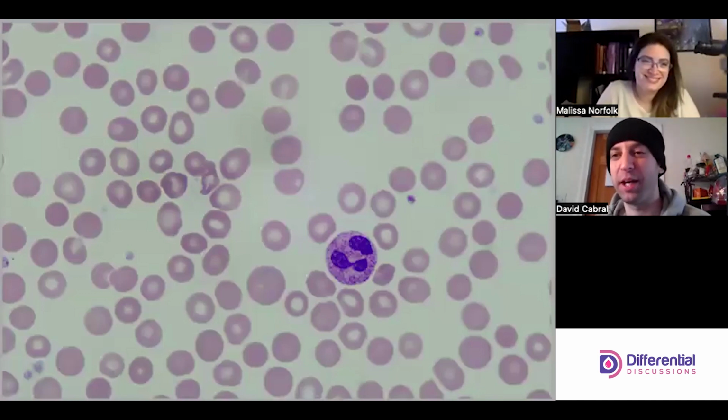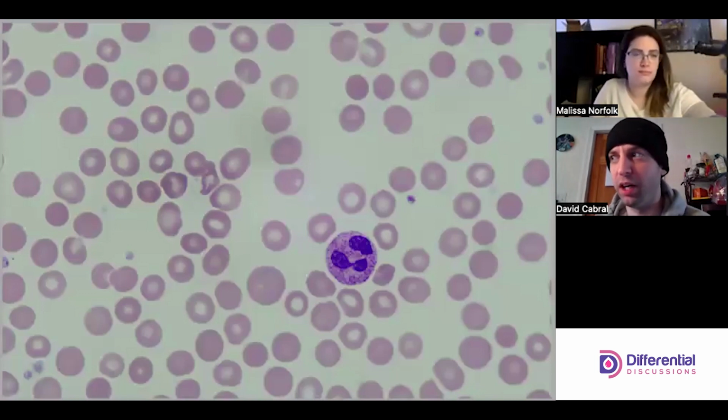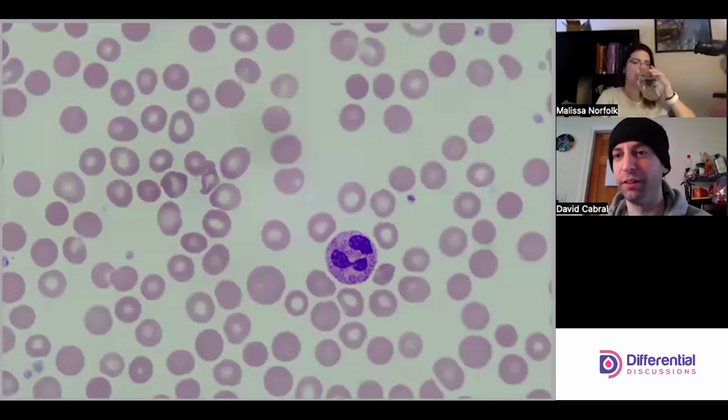So we saw this quite a bit where we worked, right? We had a heme-oncology population, and it was pretty common.